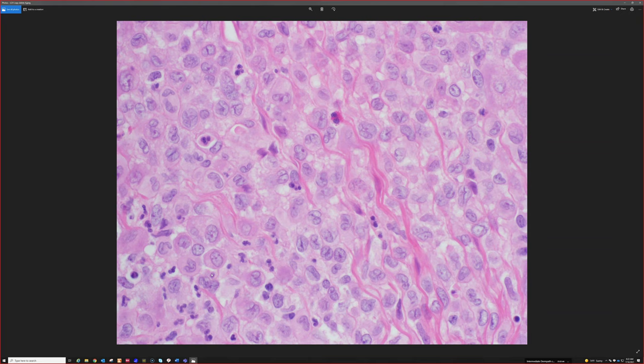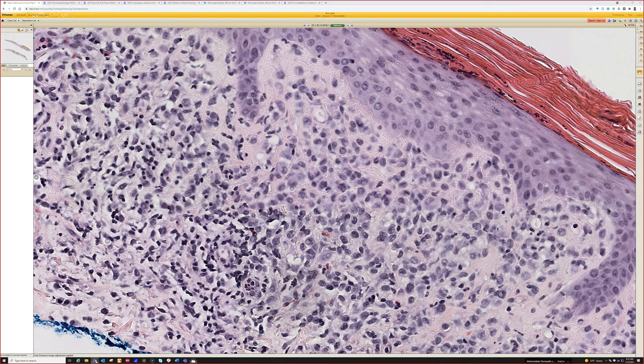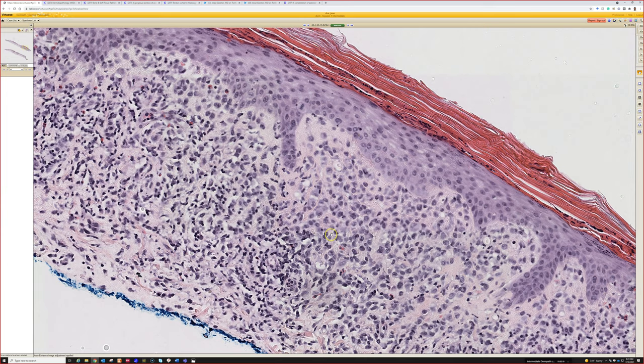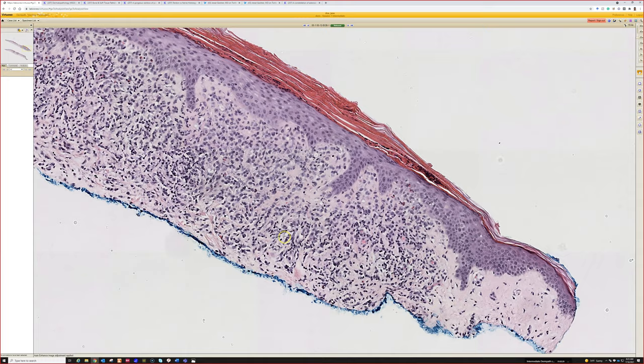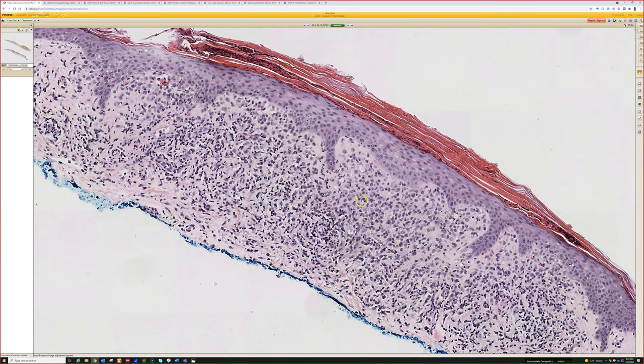Do remember there's another rare bird called indeterminate cell histiocytosis, or indeterminate dendritic cell tumor. It looks just like Langerhans and stains similarly — it stains with CD1a, which is the marker that stains Langerhans cells — but it's negative for CD207, which is called Langerin. So when I see LCH, if it fits classically and it's a kid, I usually just do the CD1a and call it Langerhans histiocytosis. But if it looks like LCH and it's an adult with a solitary lesion, I'll get Langerin to make sure it's not indeterminate dendritic cell tumor. The only way to tell it apart is electron microscopy to show it lacks Birbeck granules, or to do CD207 Langerin.